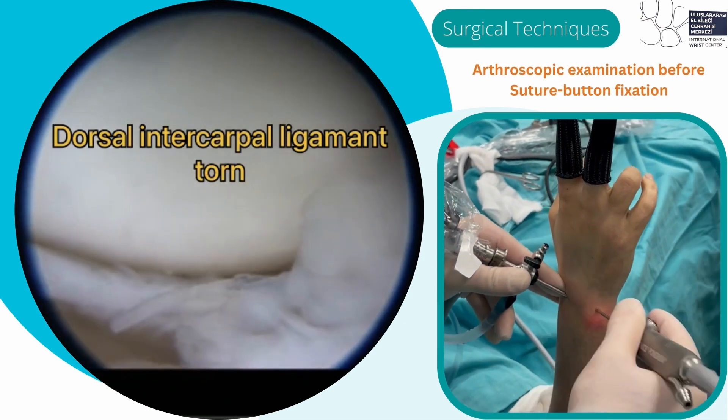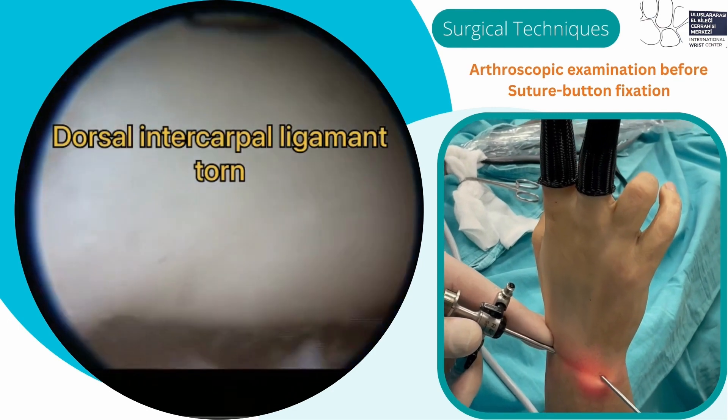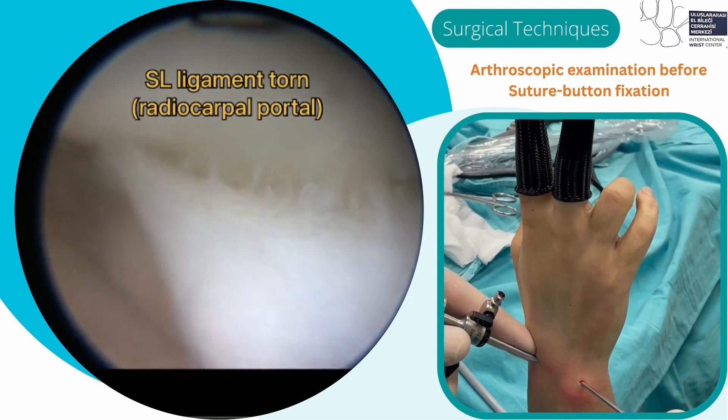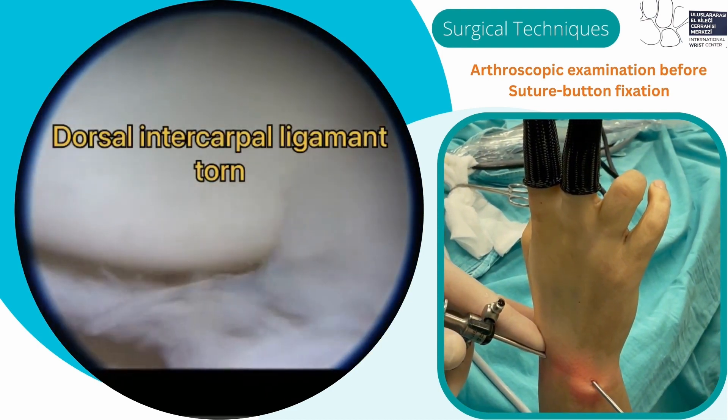Arthroscopic examination of the radiocarpal joint with the standard 3-4 and 6R radiocarpal portals shows that the dorsal intercarpal ligament was torn and the SL ligament was torn over the radiocarpal joint.